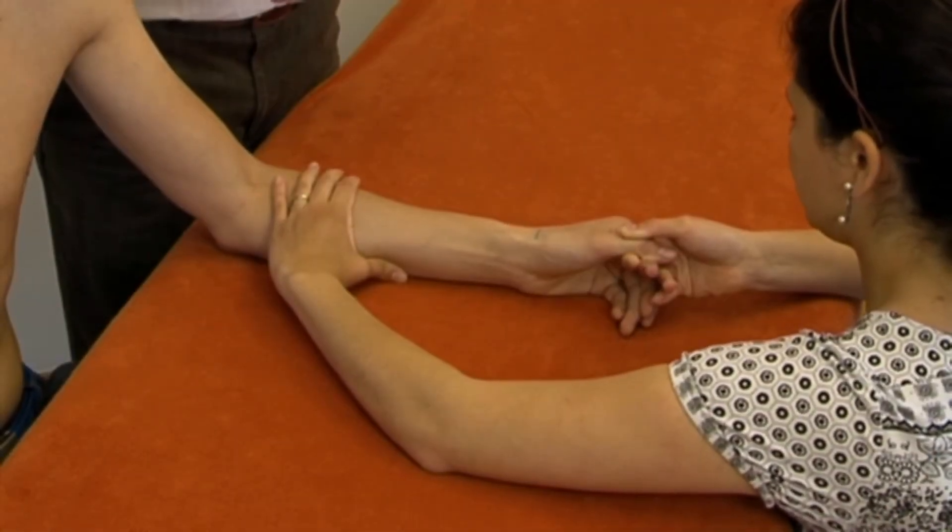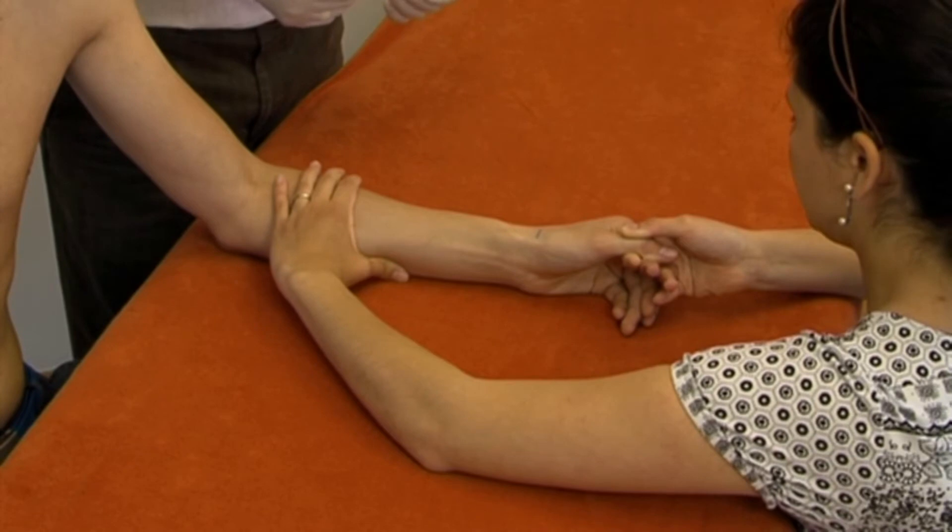The joint is made more accessible by an assistant pulling on the thumb and exerting counter-pressure on the patient's forearm.